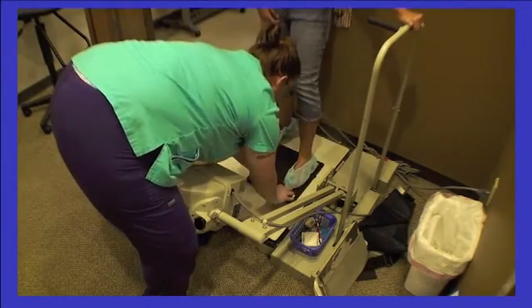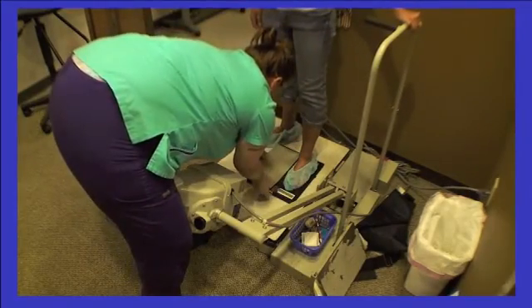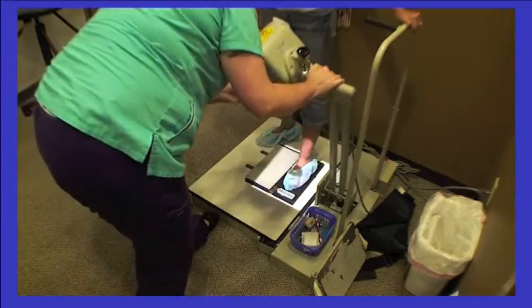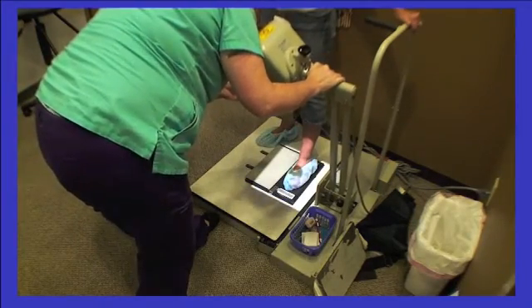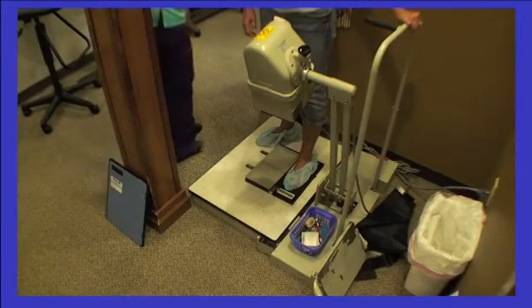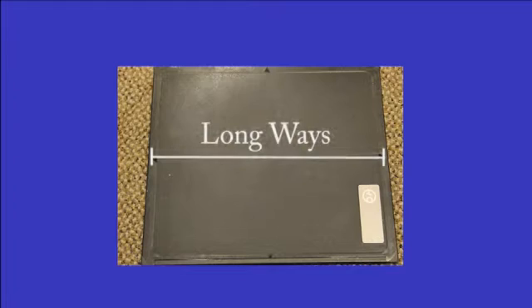At this point, you will make sure the X-ray cassette is prepared by having the patient label and left-right indicator in position. When you take the X-rays of a foot or ankle, you will very rarely take just one view, so any X-ray cassette is just big enough where you can split it long ways and separate each side to house a different view. When taking the AP, the usual step next is to take a lateral view, so the AP and lateral will be housed on the same film.